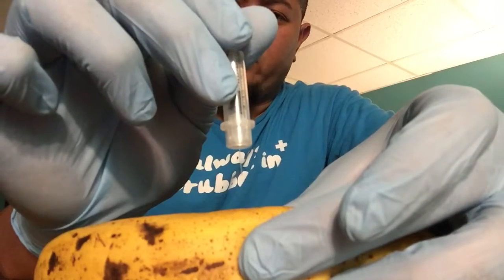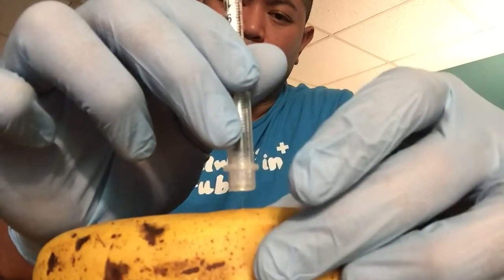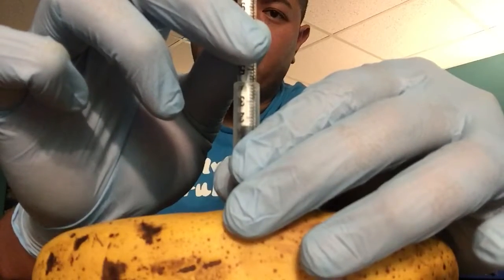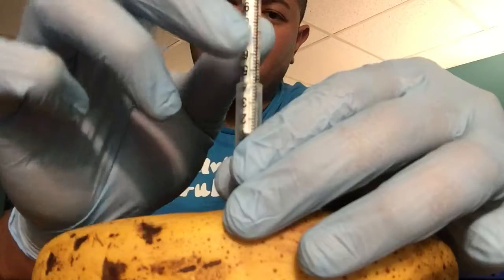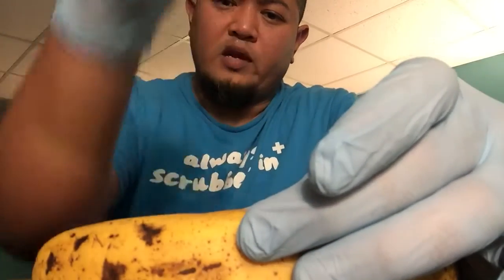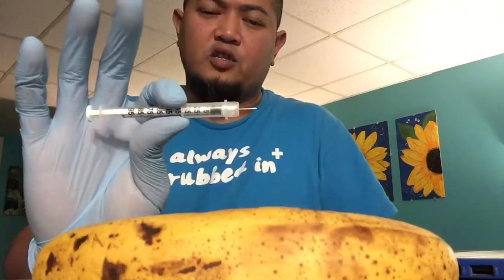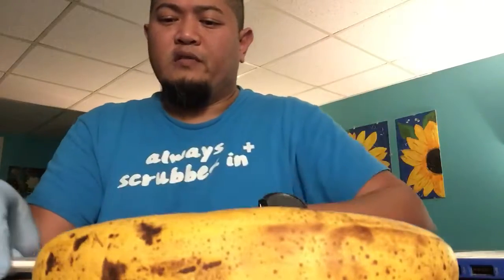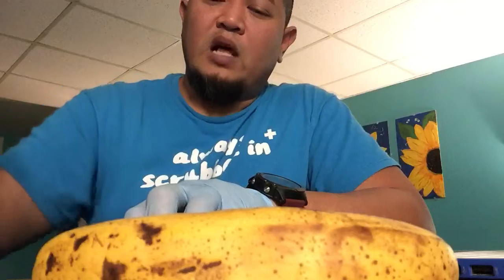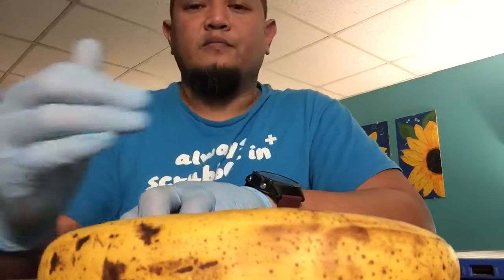You're gonna inject it really quick in one smooth action. You're gonna hold it with your non-dominant hand and then push the medication in, and then make sure you pull it out straight so the patient won't have any discomfort, and you get rid of that in the sharps. After you get rid of that in the sharps, you can go ahead and blot the site.